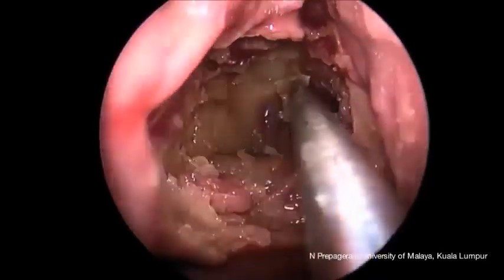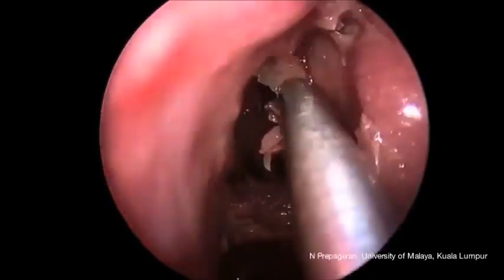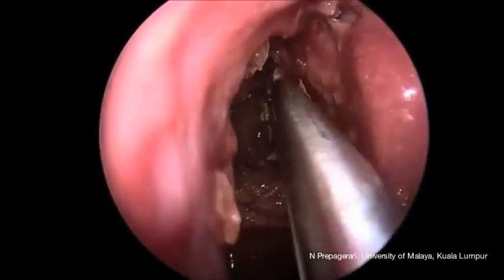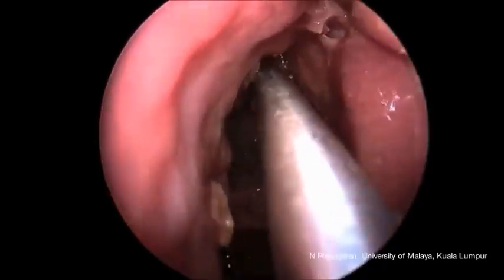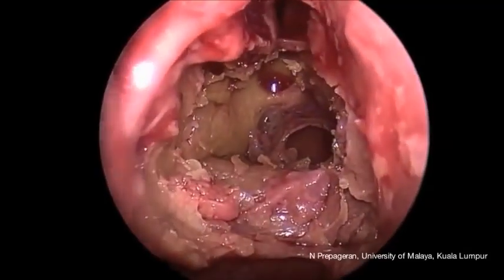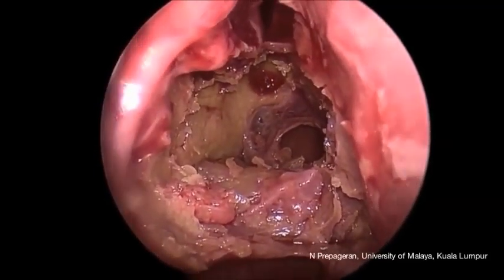So this is a total ethmoidectomy, and again, you can appreciate how this can be done very quickly, in a matter of a few minutes with very few instruments as well. And this can be performed in real life with the same speed and the same instruments, once you are comfortable with the anatomy. And obviously in real life, you will preserve the mucosa as much as possible.